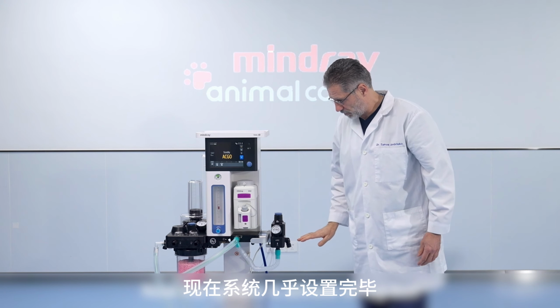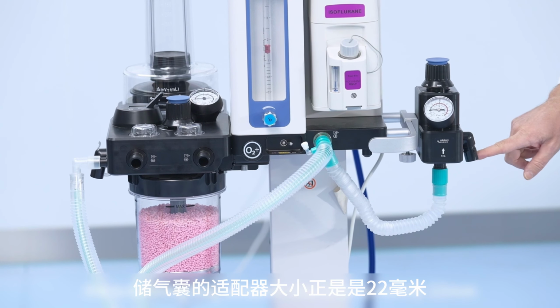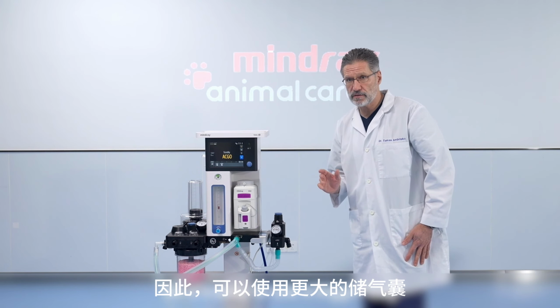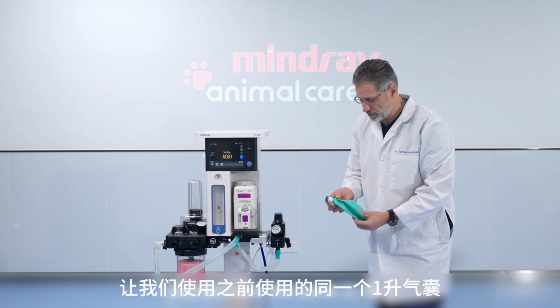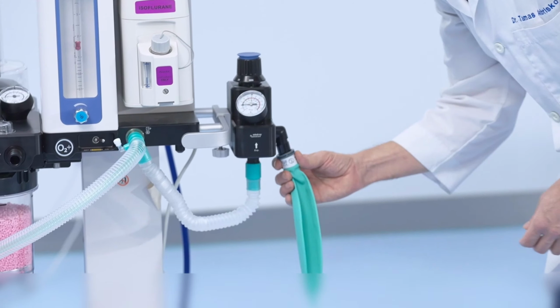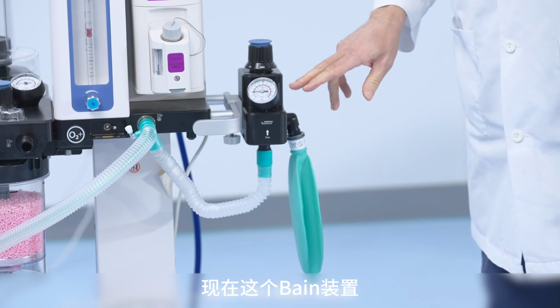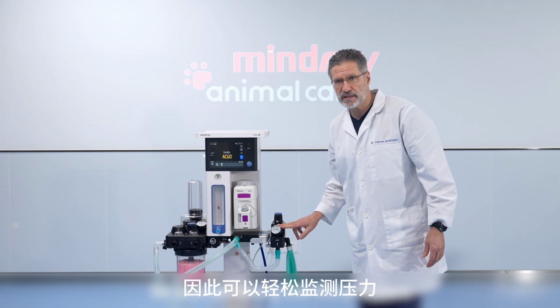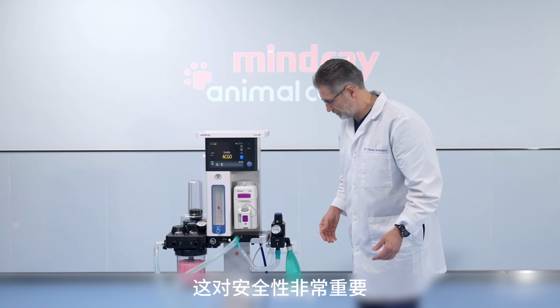Now the system is almost set up, but we need the breathing bag. The breathing bag adapter size is fortunately 22 mm, so it's easy to use a bigger bag. And let's use the same 1 liter bag that I used before. And we can attach it here. Now this Bain block fortunately comes with a pressure gauge. So you can easily see the pressure when you ventilate the patients, which is very important for safety.